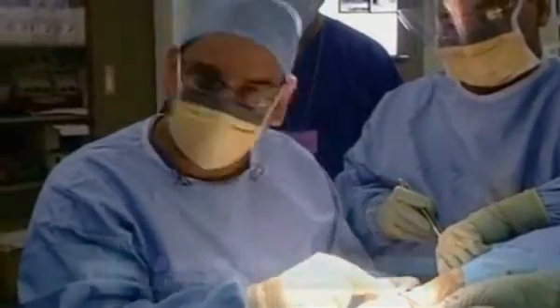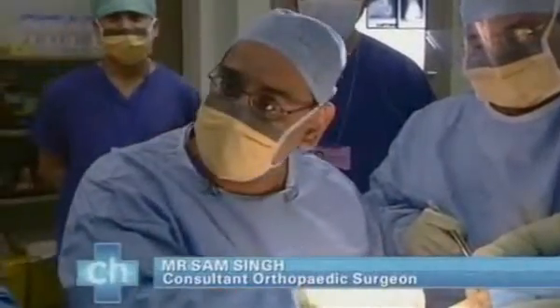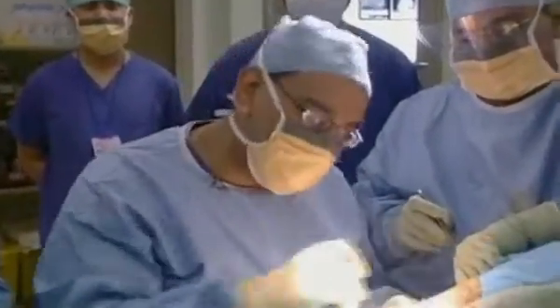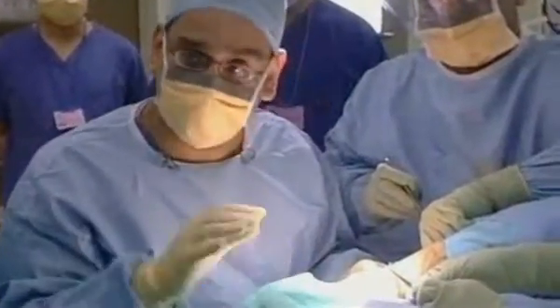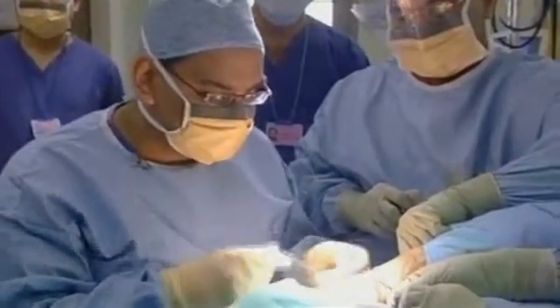So we're going to reinforce the tissue so that it stops happening, and on top of that we're also going to make the groove in the bone deeper. So we're going to basically carve out a part of the bone, push it in so that this groove, so the tendon stops jumping. Now, I see you're using those red rubber bands, aren't they?